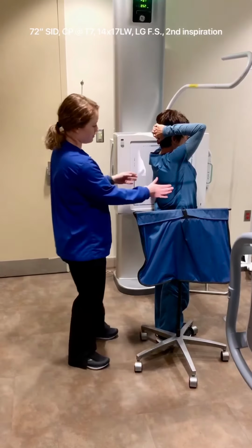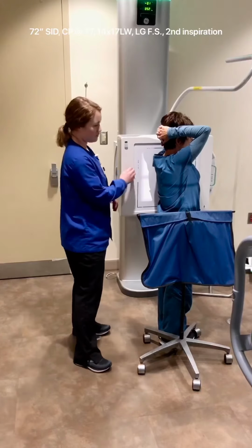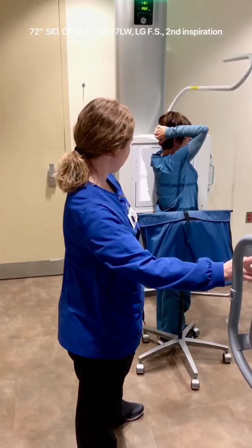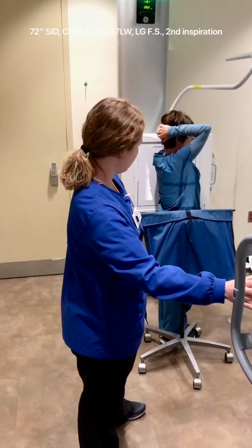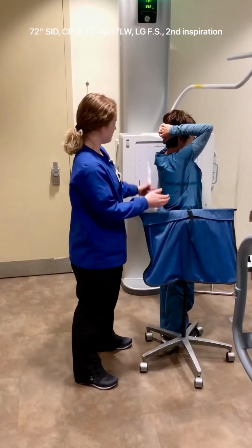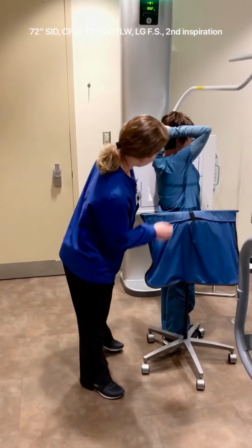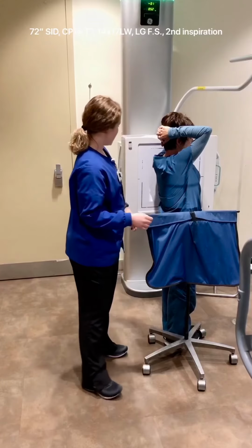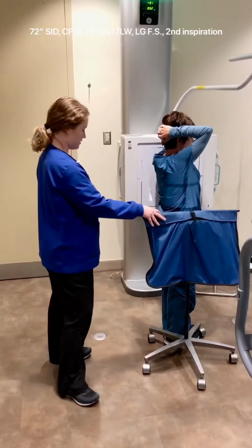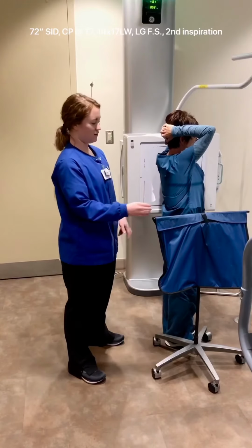You still are centering at her inferior angle of the scapula. She's about in the same spot, so we won't need to bring it down. Then you want to collimate in as much as you can, and you want to center the vertical line to her mid-coronal plane. Make sure there's no rotation. Make sure she's standing shoulder width apart. Please step your feet up, so then you don't have any motion.